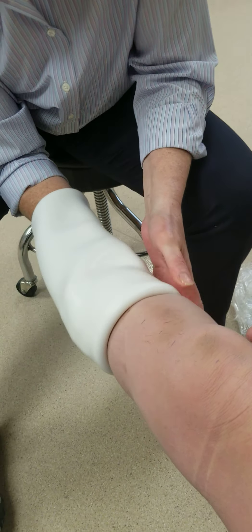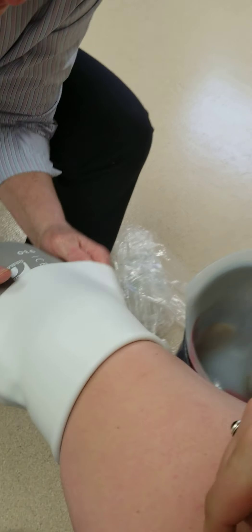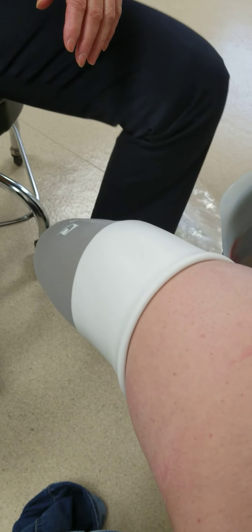I'm going to have you try to roll it on because it's so oily. I knew when my knee started going below the divot — they said that's where my knee should be — so that's about as high as it would actually go.